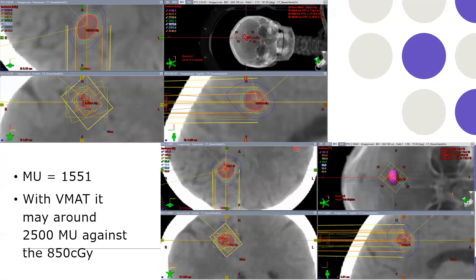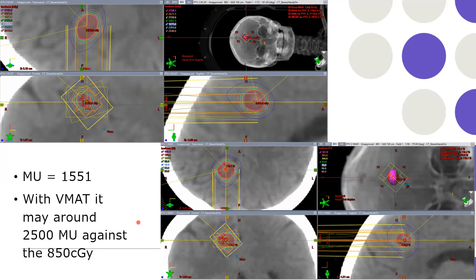This is an SRS test plan — not delivered on a patient. This is a DCAT plan versus a VMAT plan. You can see similar dose distribution with no big difference. But there is a huge difference in monitor units — DCAT gives fewer monitor units compared to VMAT, which gives around 2,500 monitor units against 850 cGy dose. So one can consider DCAT for SRS if the target is quite circular and homogeneous.